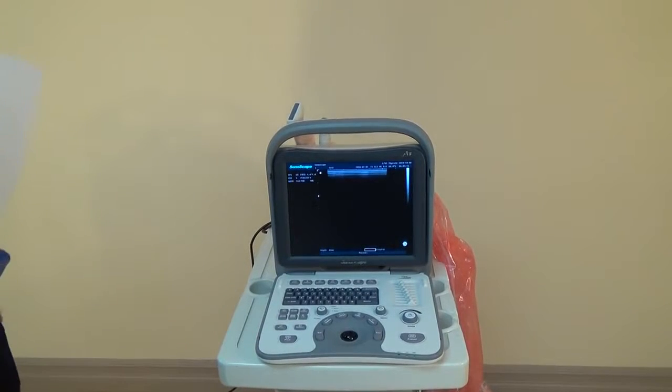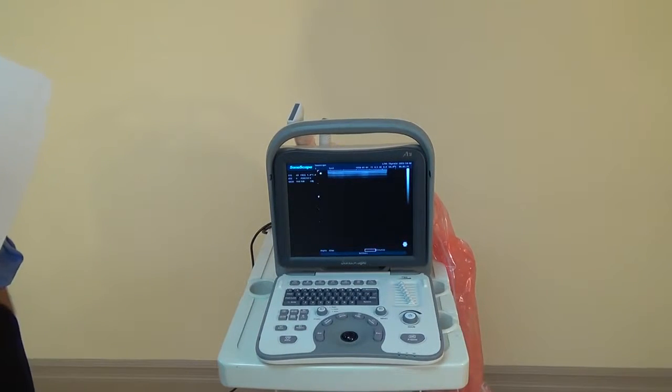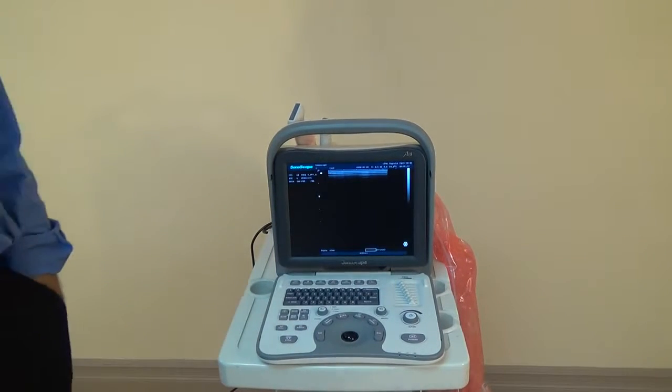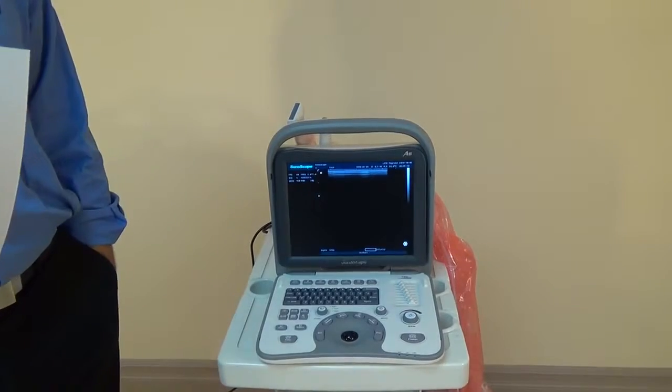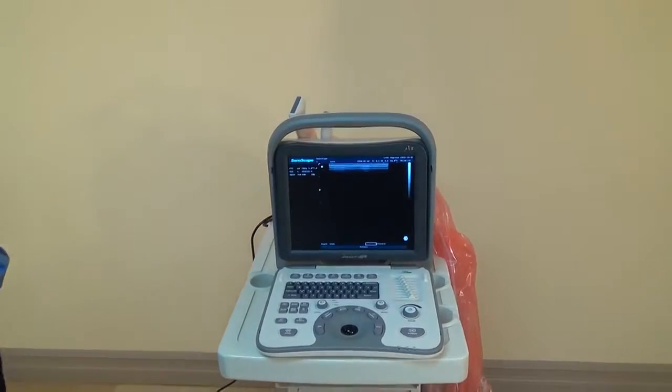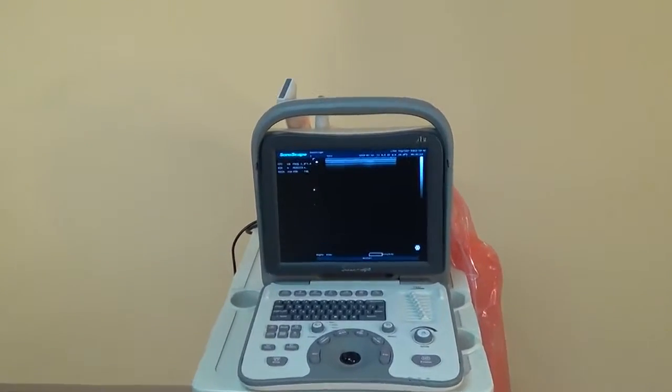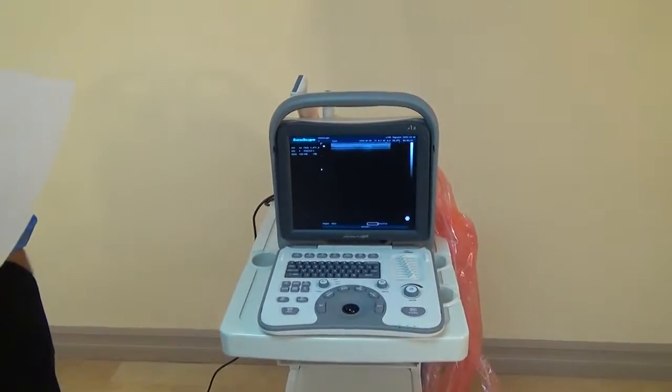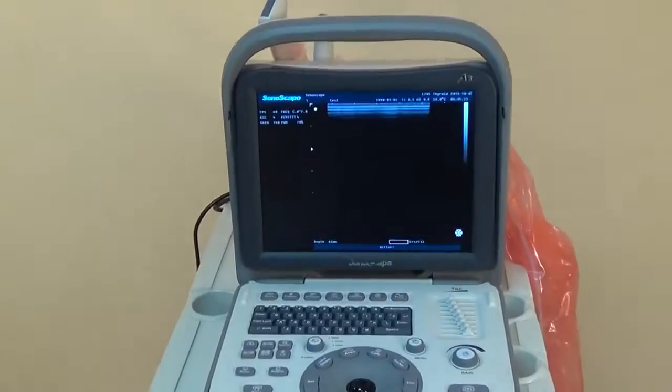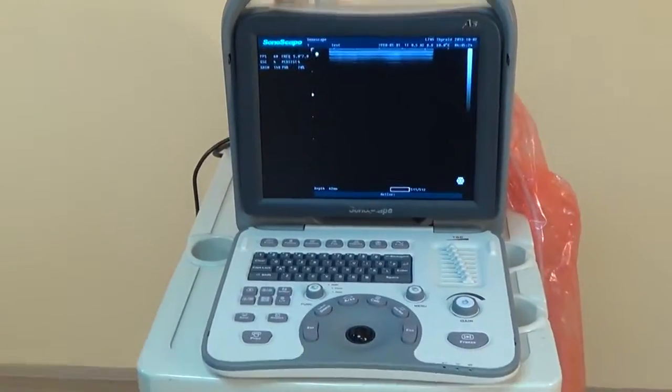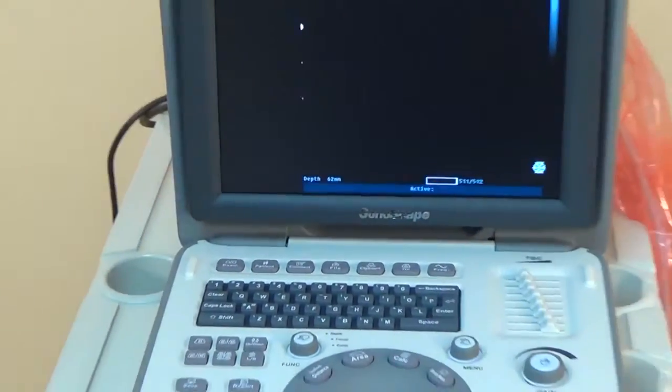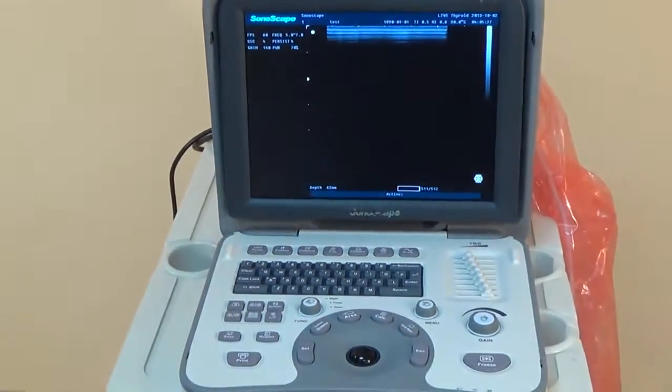Alright, this is Theo from Kivomed again, going over some of the keyboard features of our A6 Sonoscape Ultrasound Machine. We had some other videos on the machine, on some of the functions, capabilities, and the benefits of this machine. We're just going to go over the keyboard here really quick.